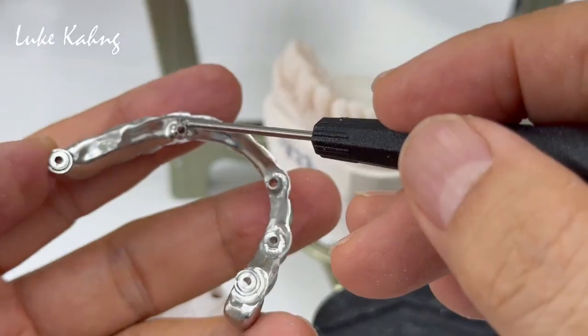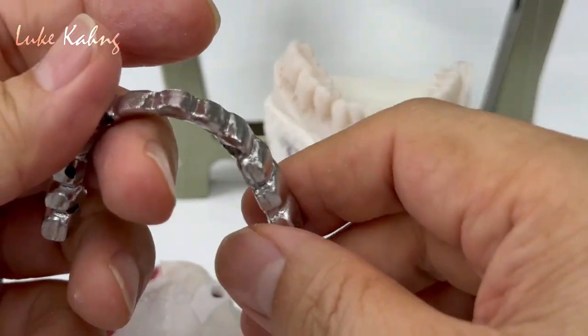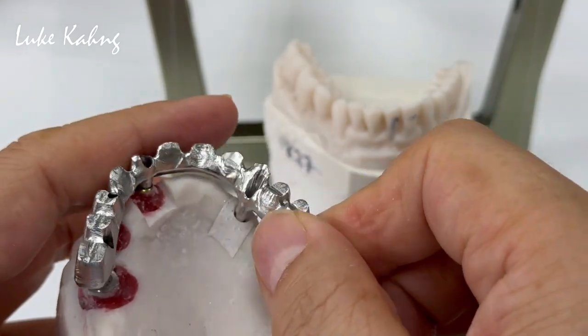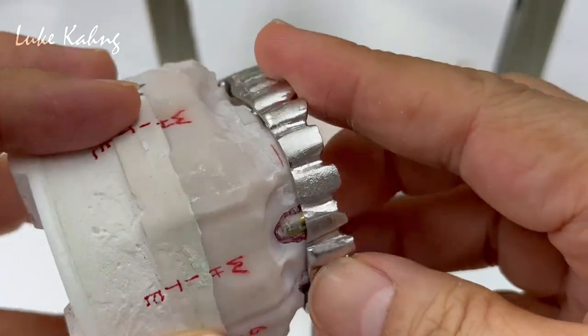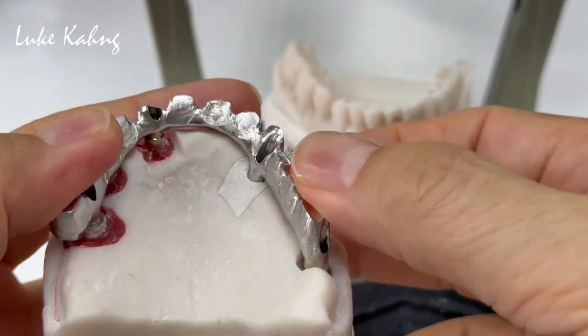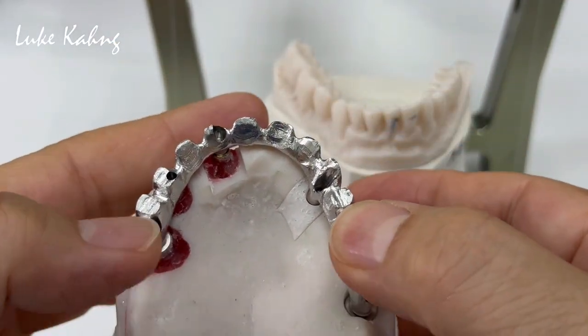Trying to open it up to seat it all the way down. Okay, so finally we did it. Then match it, and then using three different screwdrivers.